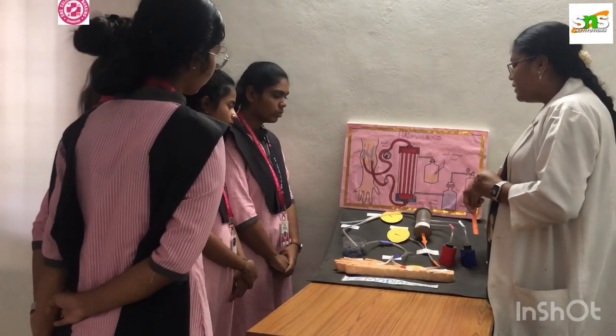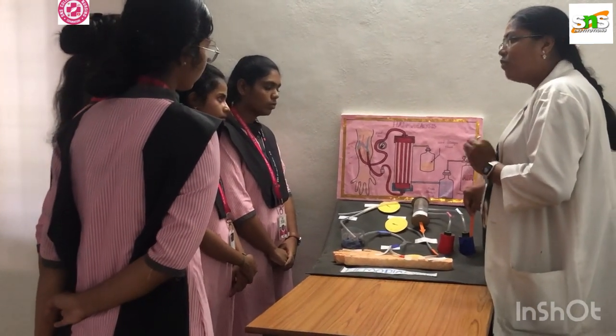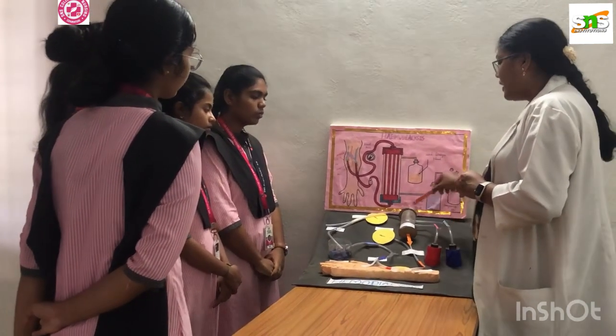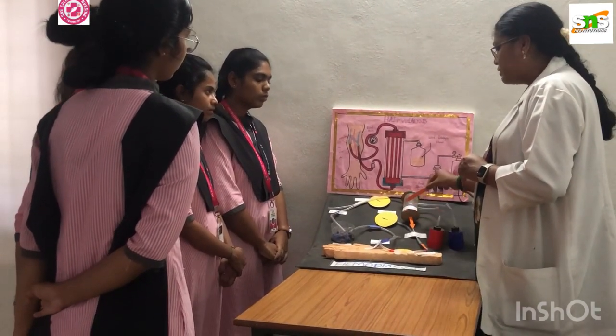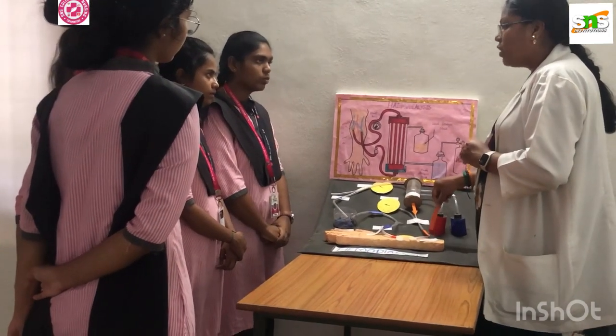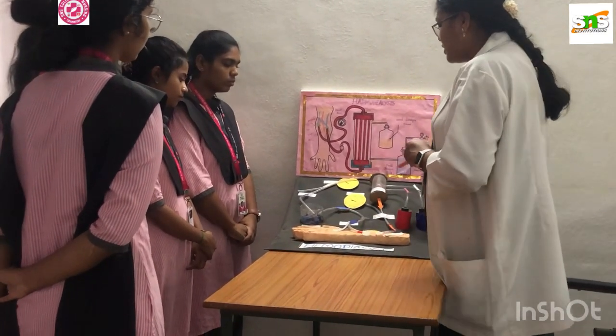Air will be trapped, and the dialysate fluid carries electrolytes so that it can take off the waste products and neutralize the blood concentration of electrolytes. This is how the dialyzer machine works.